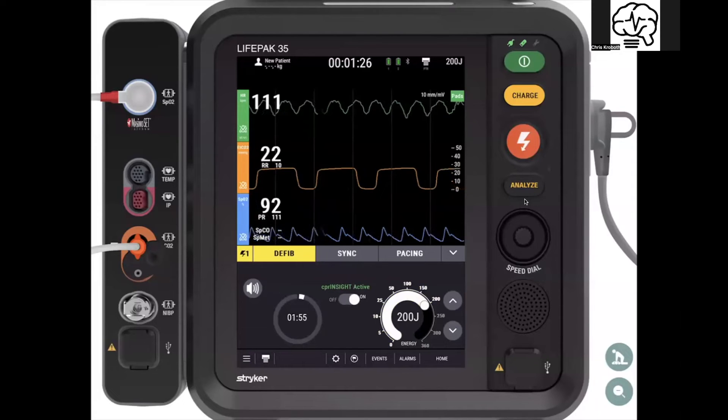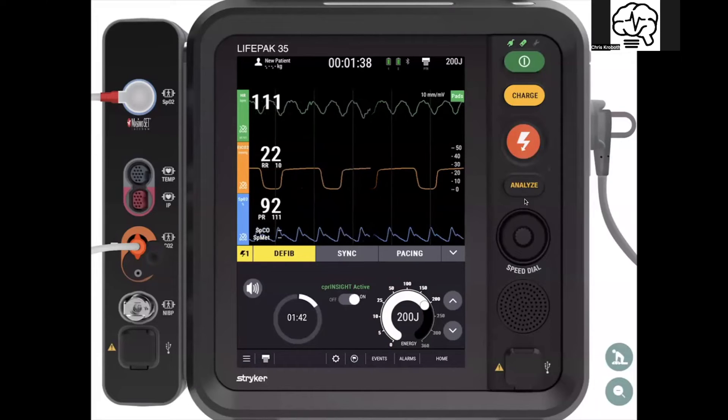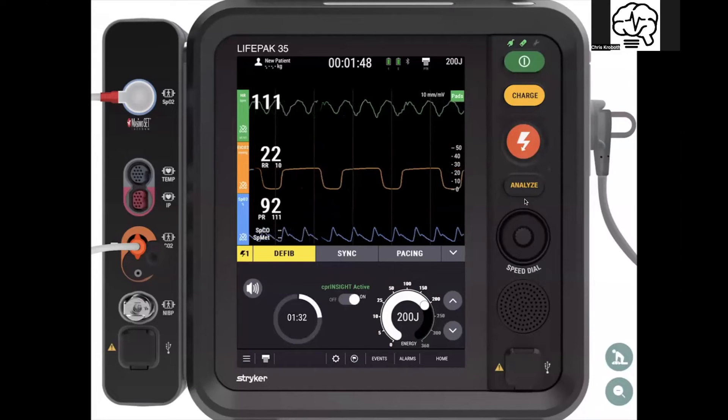You have the two-minute timer and the metronome — all of that lives right here on the dashboard. It's a much cleaner interface. Everything in terms of managing the electrical therapy within that two-minute cycle lives right here.